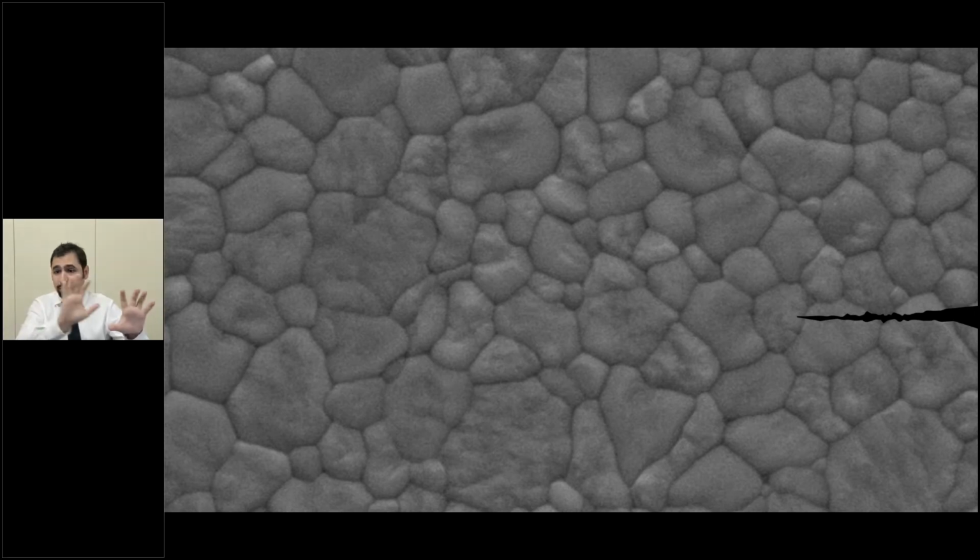And when we have a 4Y, we have something in between, a middle range of that self-healing property. It's not losing it that much, but it still has a higher amount of cubic phase than the 3Y generation. That's why it's more translucent. So I think 4Y is a nice balance between the mechanical properties and the optical properties of zirconia.